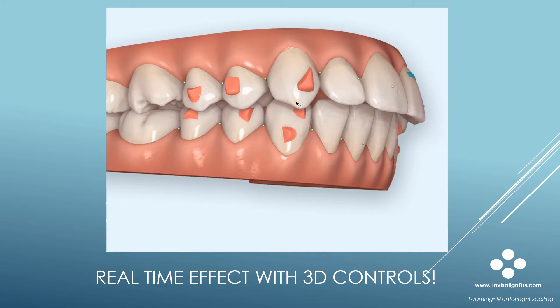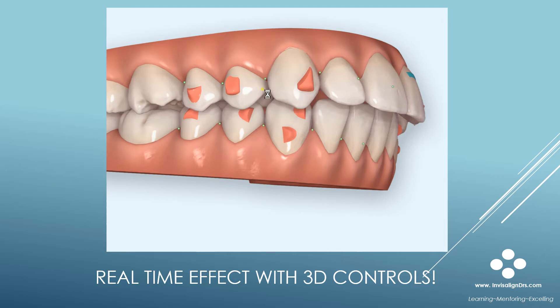Here's a class 2 case. Upper right IPR was added to improve the right cuspid relationship. Note the real-time effect of adding that IPR in the upper right quadrant.